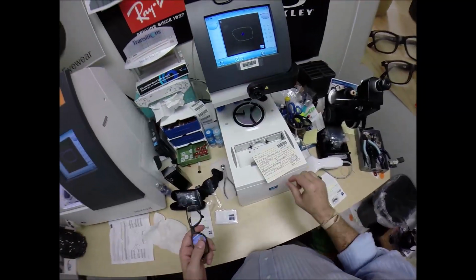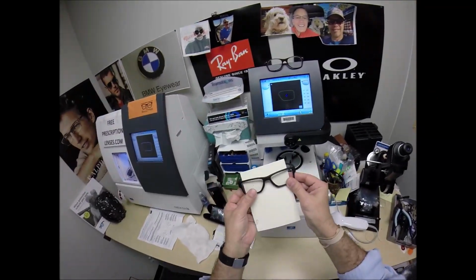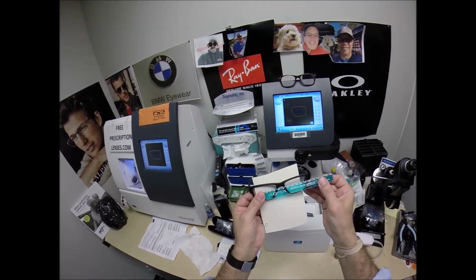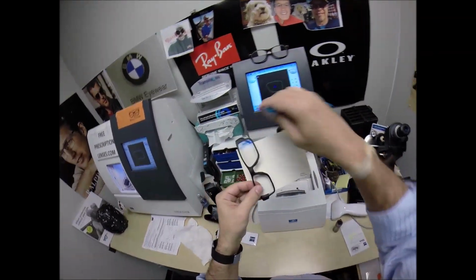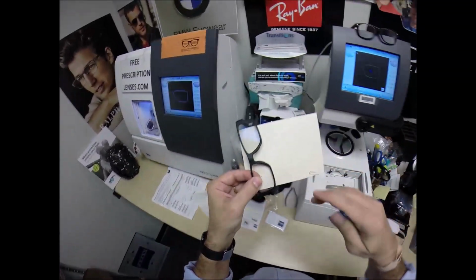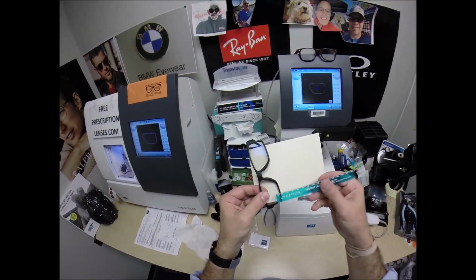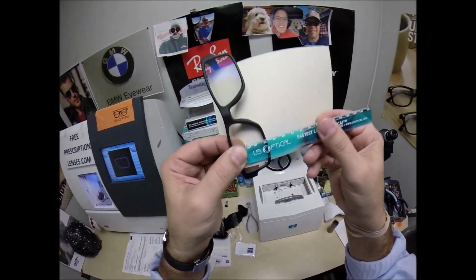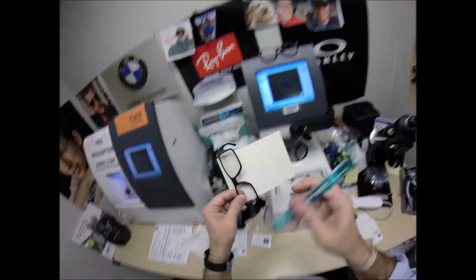So, let me measure your PD, 32.5, 30. So I'm going to turn that card around, place the PD stick against my thumb. When we hold it up to the left lens, we're measuring that. That's perfect. Let's check the 19 for the optical center height, the seg height, the position of wear height. It goes by a lot of names. Not to the bottom of the lens, but to the middle of the plastic. We're going to measure 19 millimeters. That is cut perfectly. 19 millimeters.